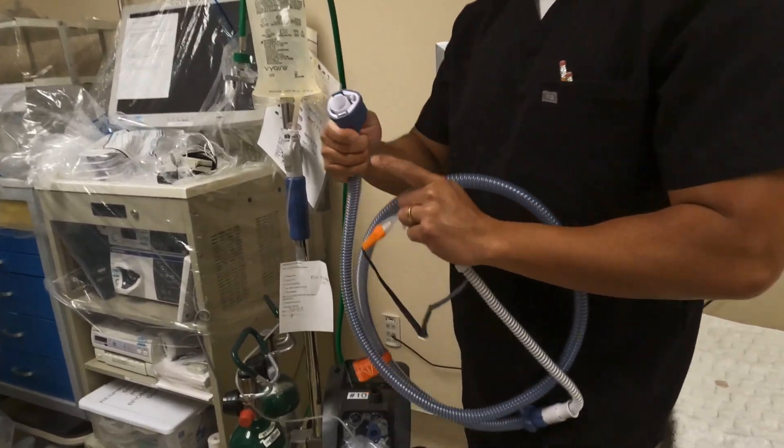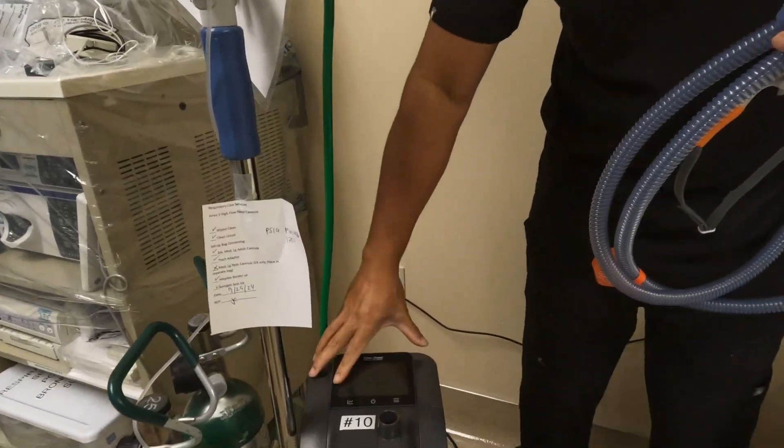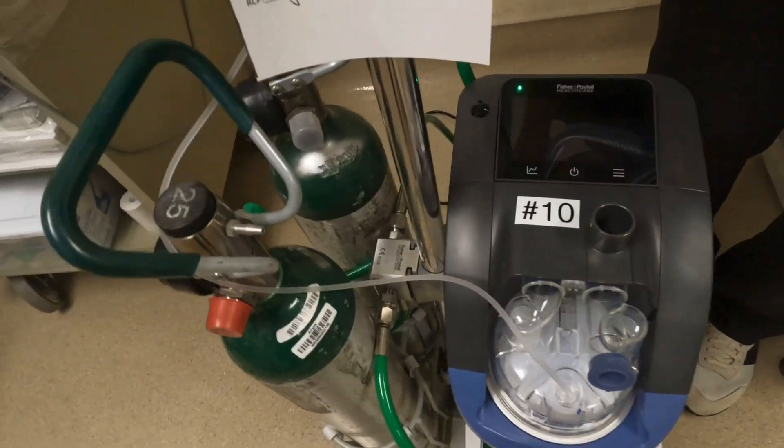When you attach this, you're going to see some prongs. You also want to match that with the prongs of the Airvo3, like so. When inserting it, you'll also hear a click.